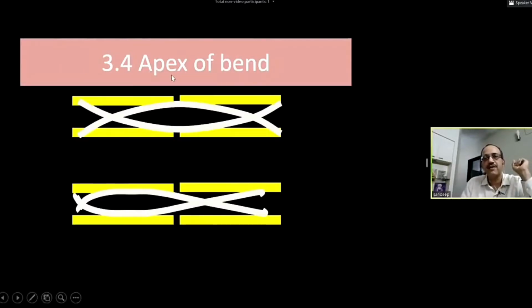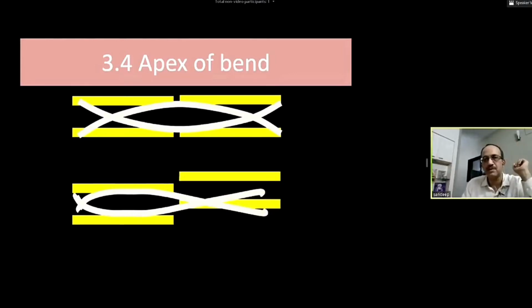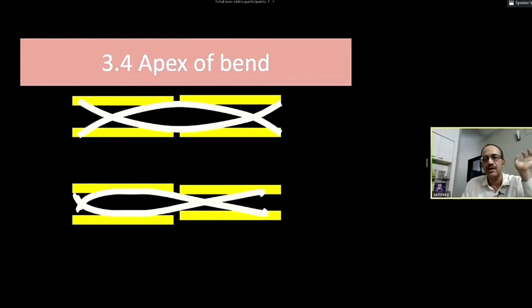The next point is, where should the bend be? The apex of the bend should come exactly at the fracture site. If the apex of the bend is not at the fracture, the spindle is not formed at the fracture. So this creates relative instability, and that will not succeed. So the bending has to be exactly at the fracture apex. The height of the bend should be 3 times the diameter, and the size of the nail should be 0.4 into the diameter. So these are the nail and bending principles which you should know, so that your nail spindle is perfect.